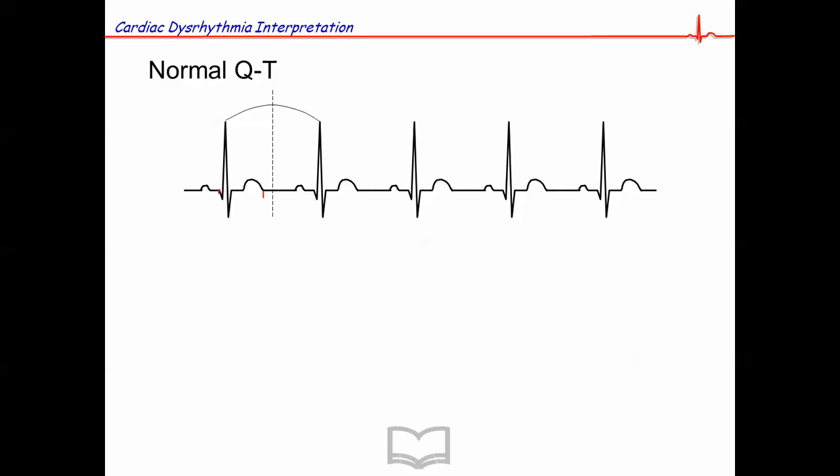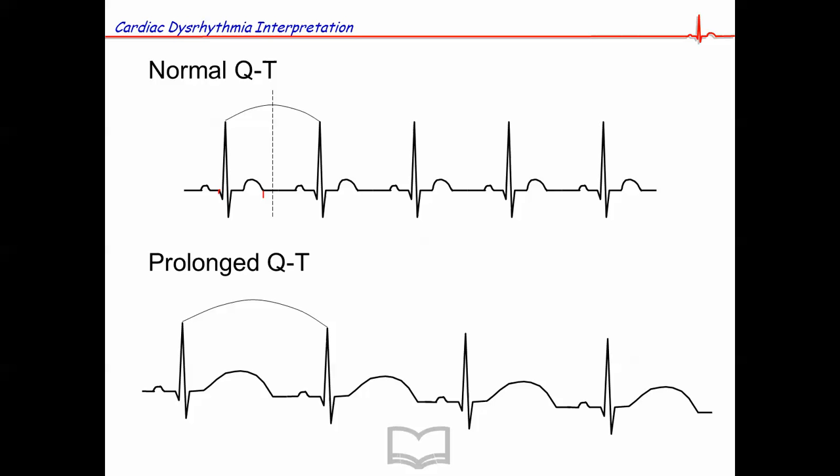In a case of prolonged QT, what we see is the QT interval is greater than half of the R to R interval. Here's the onset of the QRS, here's the end of the T wave, and you can see it ends later than the halfway mark between the two R waves.